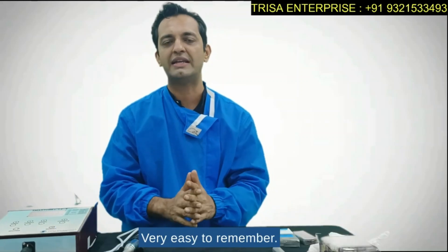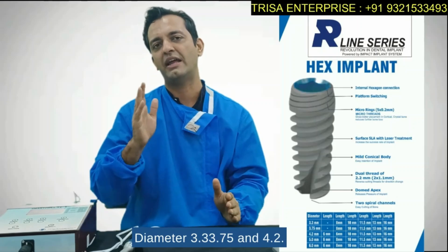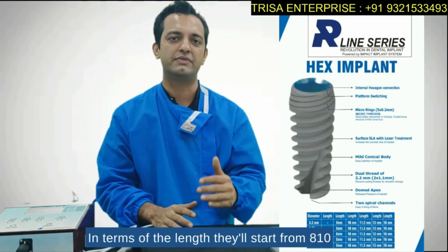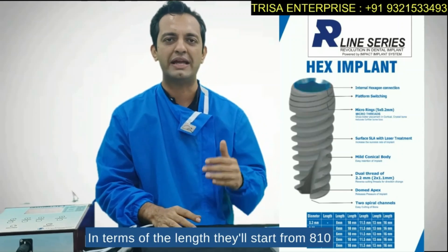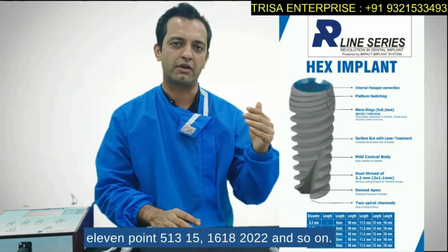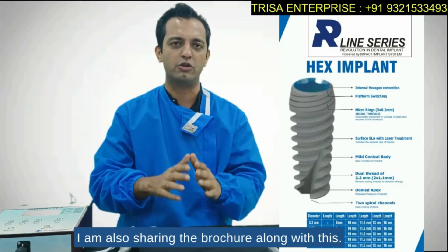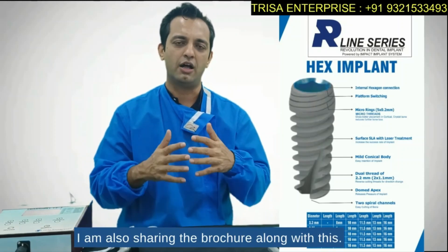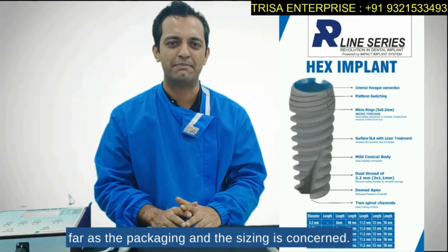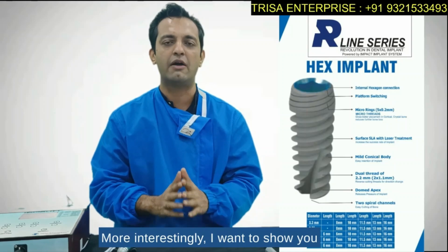The sizes are very easy to remember: diameters are 3.3, 3.75, and 4.2 — universal for both implants. In terms of length, they start from 8, 10, 11.5, 13, 15, 16, 18, 20, 22, and so on. I'm also sharing the brochure along with this video so you can refer to it for packaging and sizing details.